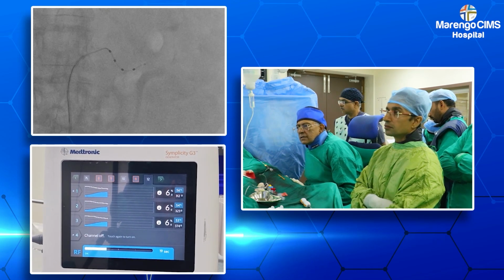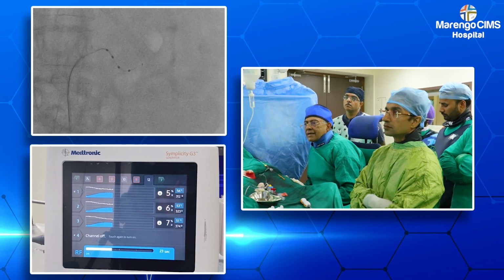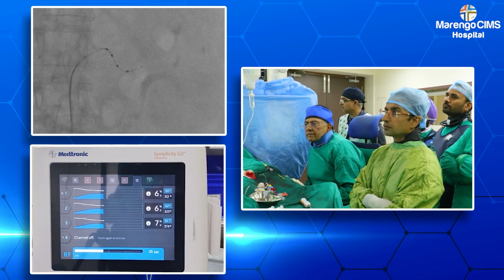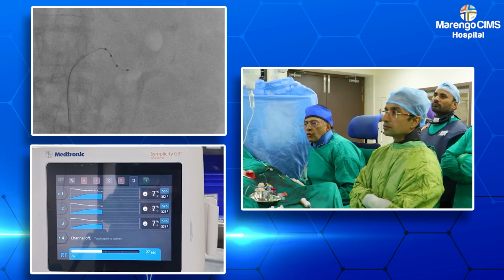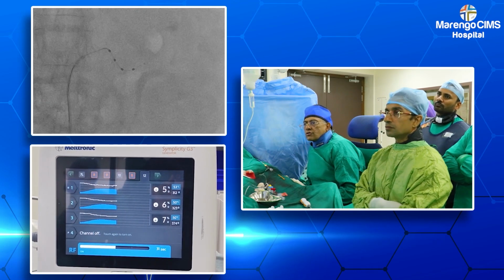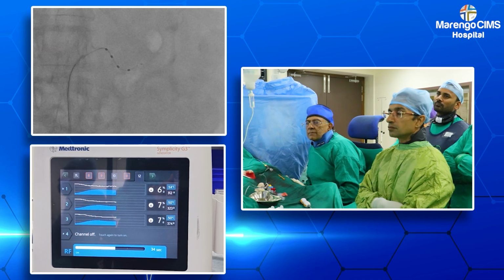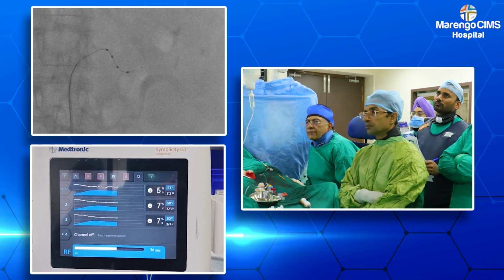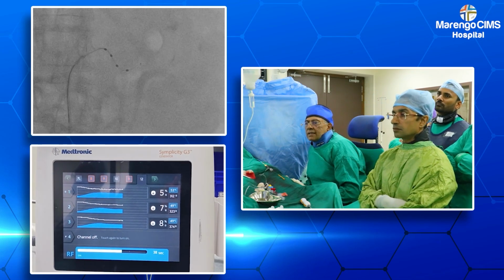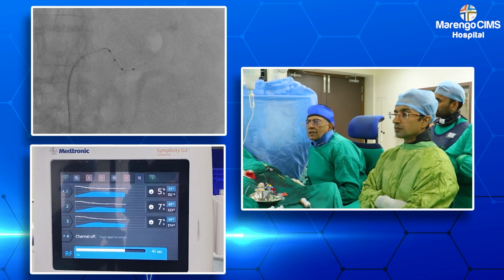Again, in the early Spyral or the early RDN catheter of Medtronic, which I was fortunate to do 4 cases, among the first in India in October 2013, we used to do very limited ablation, maybe single contact for ablation per artery. And as you see in today's case, I have not counted the total ablation.